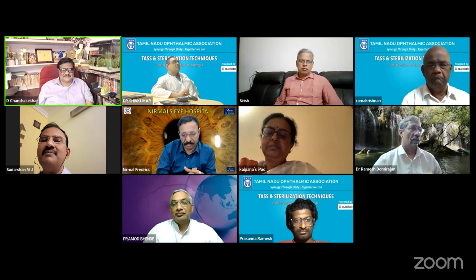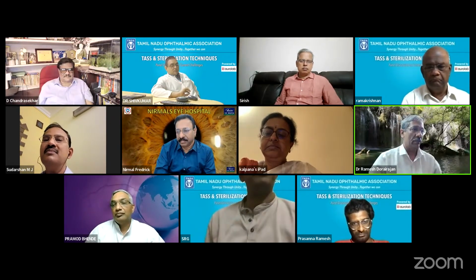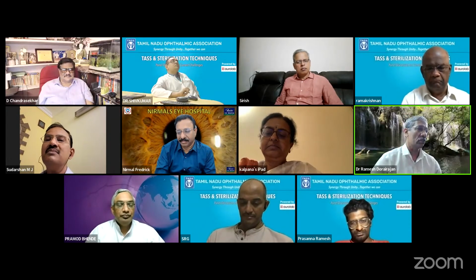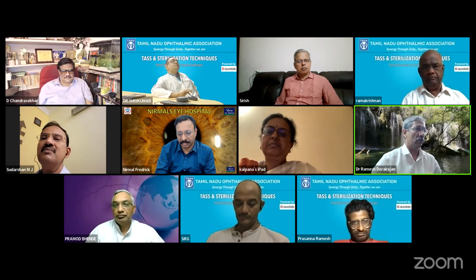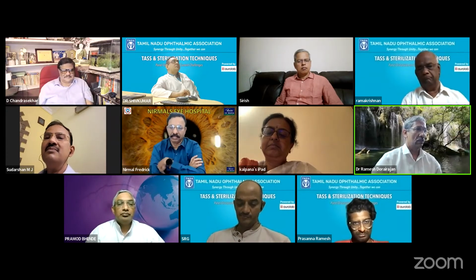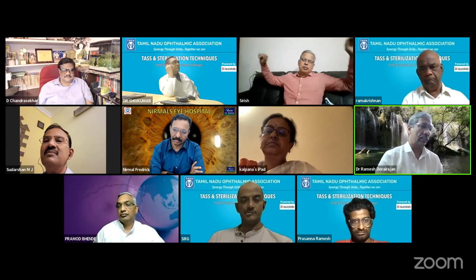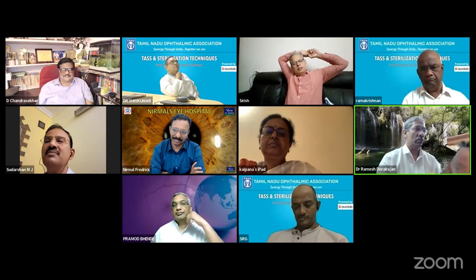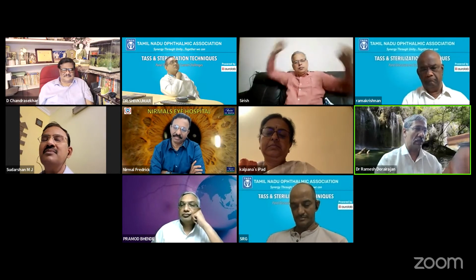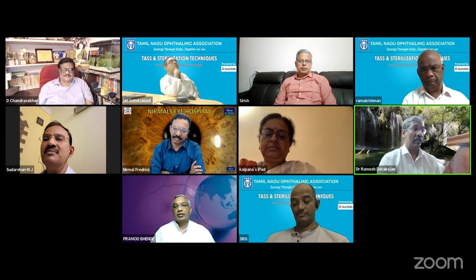Dr. Ramesh? I think mostly it has been covered, but personally, I feel that my problems have happened because the OVD has not been cleaned properly and has been coating the instruments or the cannula. I think the cannula is very important. We should replace it more frequently if you can afford it, for each case, otherwise at least every week. So washing is very important, and also the tubings. In the tubings, the couplers are what is difficult to clean and they change color. So in my hospital, we have extra spare couplers in bulk. So we reuse the tubings and autoclave one set of tubing for each patient, and we change the couplers once in 2 weeks or once in a month. So the tubing is the old one, but we're just changing the tips. That's it.